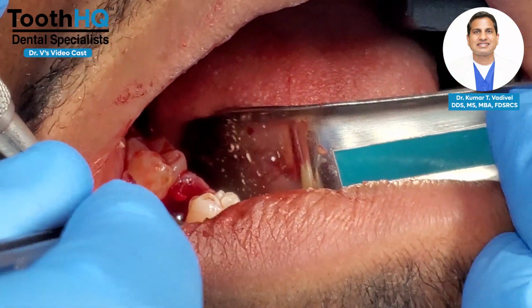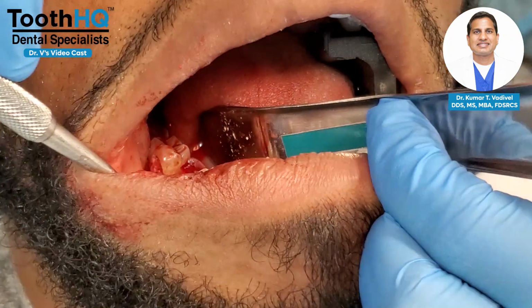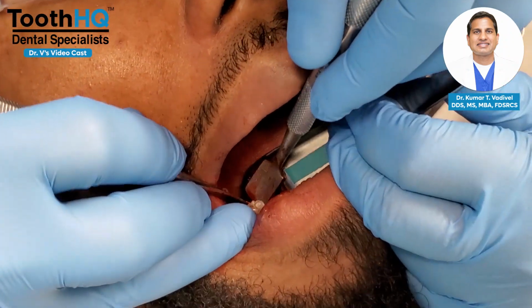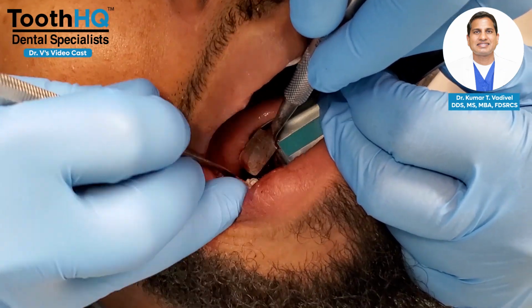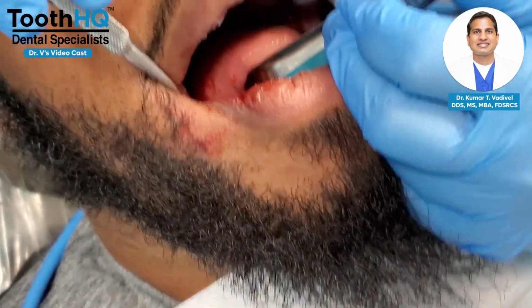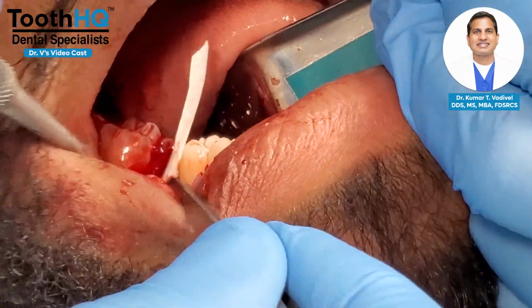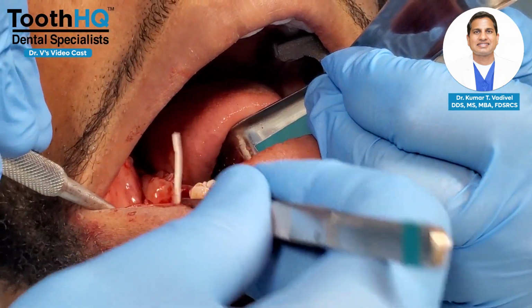So make sure that whenever you are working on a premolar, you're careful about the nerve, but you can relieve it as much as you want, and you want to relieve it on the buccal, as well as you want to relieve the flap on the lingual, because you need to be able to slide the membrane on the lingual also. Okay, so once you relieve the flap on the buccal as well as the lingual, then now you slide the membrane here on the buccal.